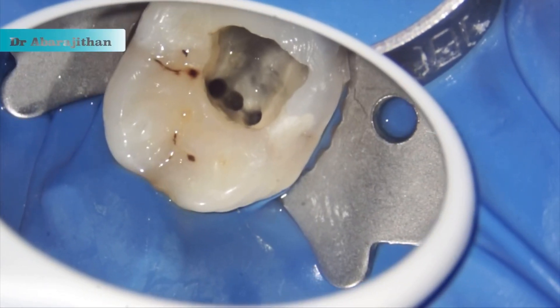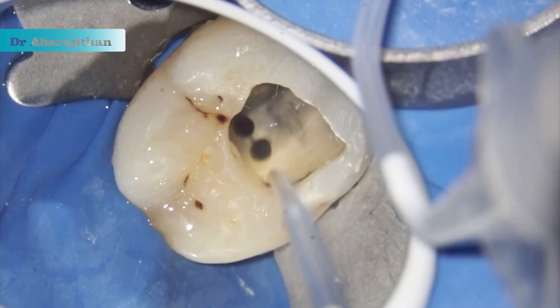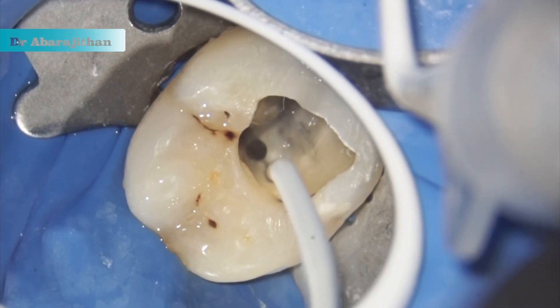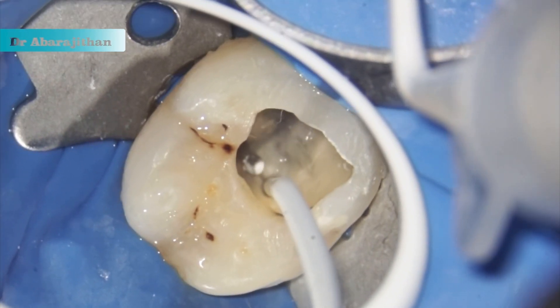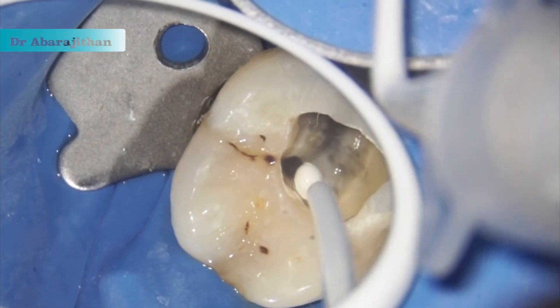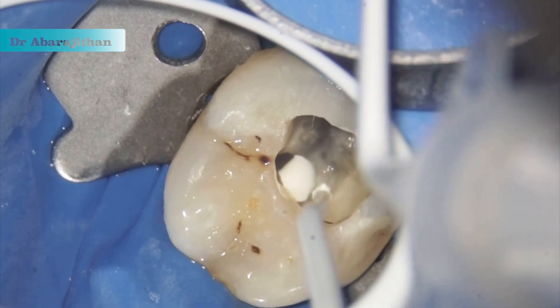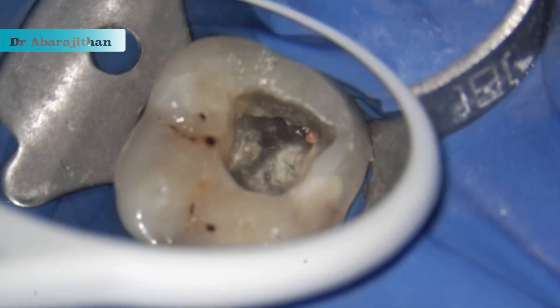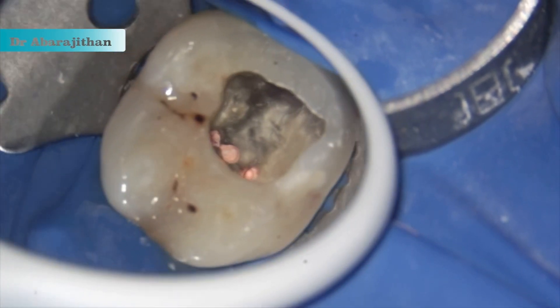This is confirmed when I place the sealer during obturation. As you can see, I am placing into the mesial buccal — I could see the middle mesial canal getting filled with the sealer, whereas the mesial lingual canal is not getting filled, which means it is an independent mesial lingual canal.